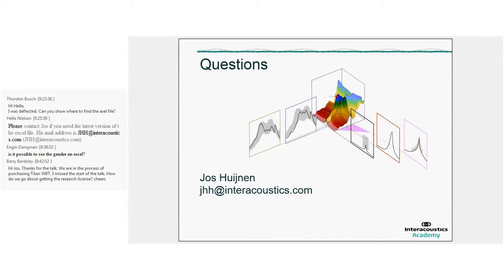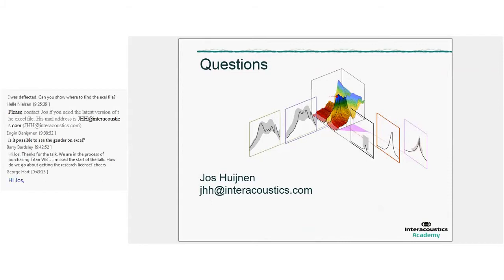If you contact your distributor, then they know how to get the research license. Just ask your distributor, and they will make sure that you get it, including the correct license.